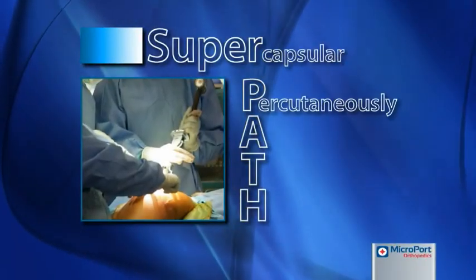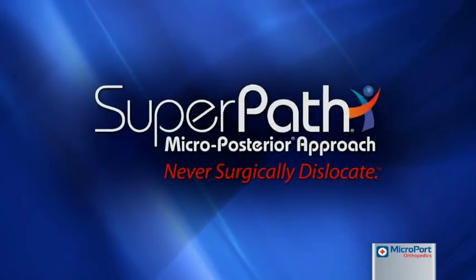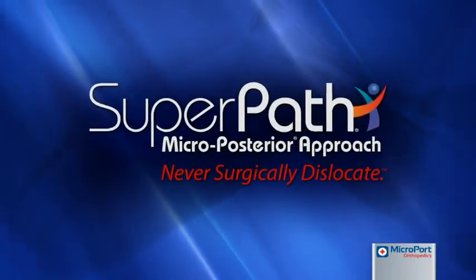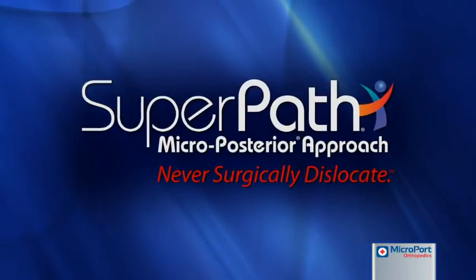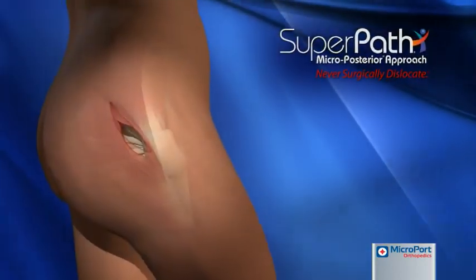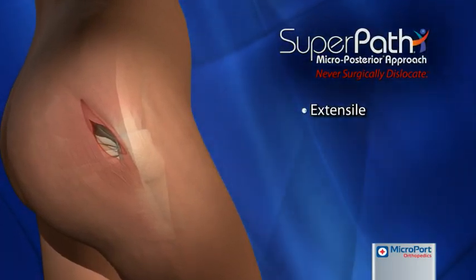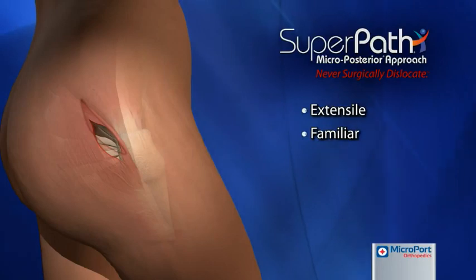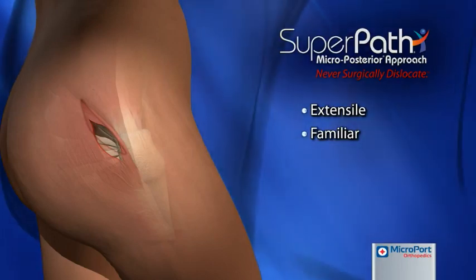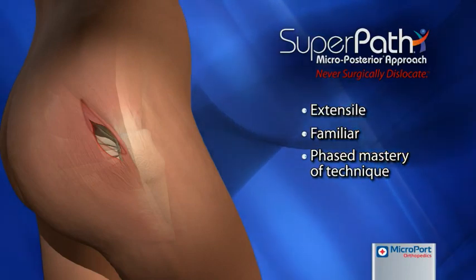The supercapsular percutaneously assisted total hip, or SuperPATH arthroplasty, is a patented approach that allows the femur to be prepared in situ and does not require dislocation of the hip. Unlike the direct anterior approach, the SuperPATH technique is extensile and capitalizes on a surgeon's familiarity with the posterior approach, maintaining a better comfort level and allowing a phased approach to master the technique.